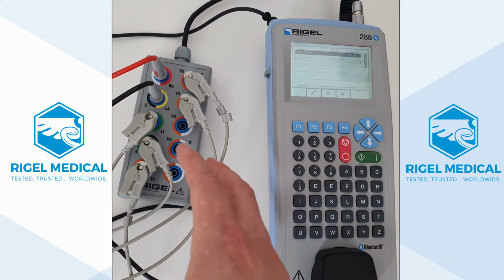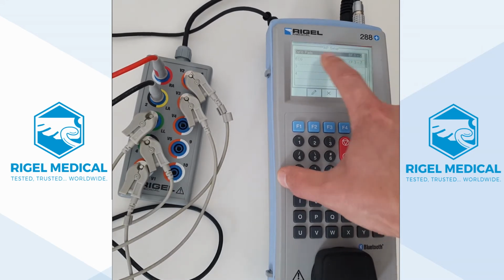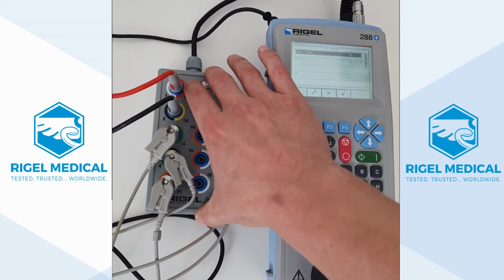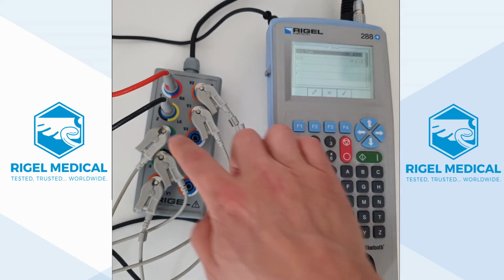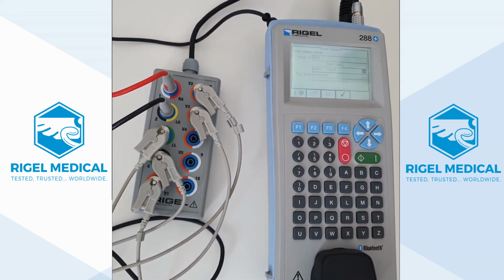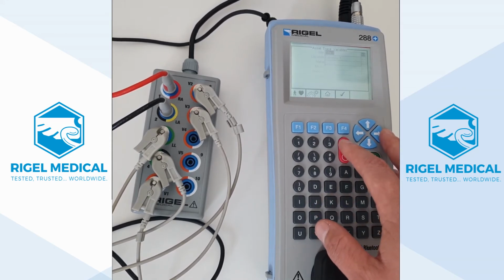We've already got the leads connected, but when we set it up, it will tell us where to place the leads. So BF 1 to 2, defib pads is 1 to 2 on the applied parts box. I won't be able to see it too well, I'll just move that over. So 1 and 2, and then we've got our ECG 3 to 7, 3, 4, 5, 6, 7. Very simple. We tick and then we go through the automatic test procedure.